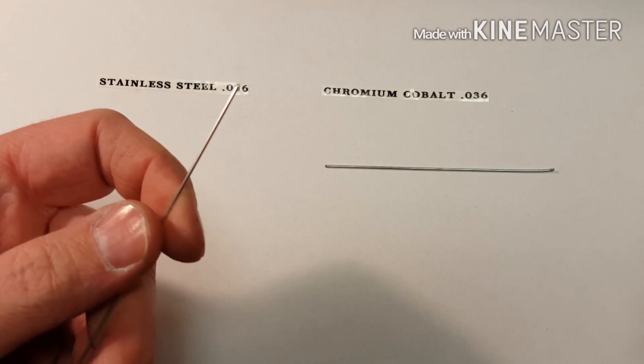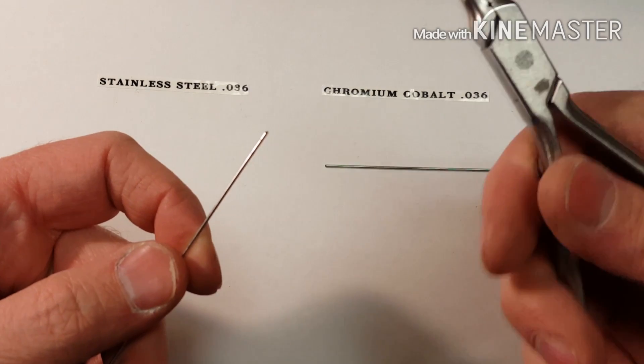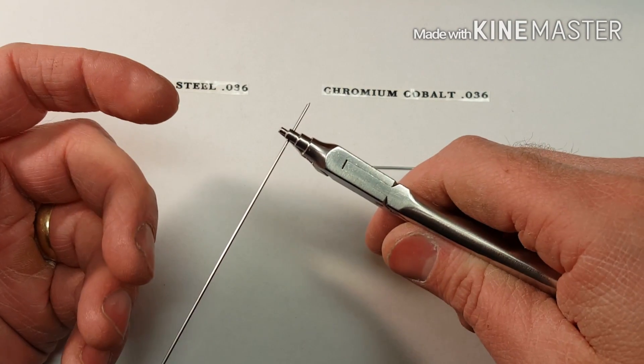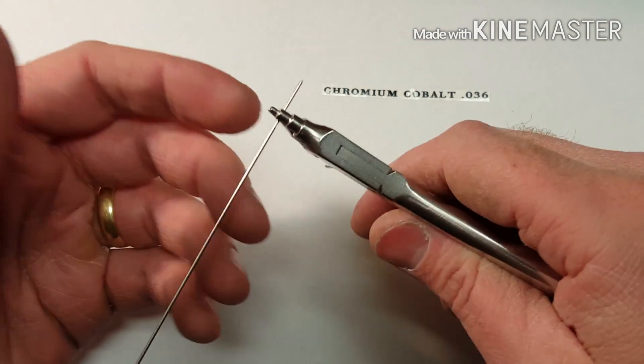You can take an 036 wire and bend it. You'll see how many times it bends before it reaches its fatigue point. This is 036 stainless steel wire — typical stainless steel.